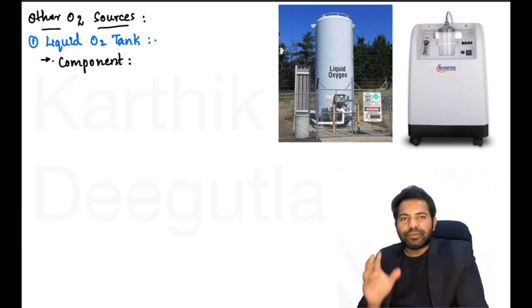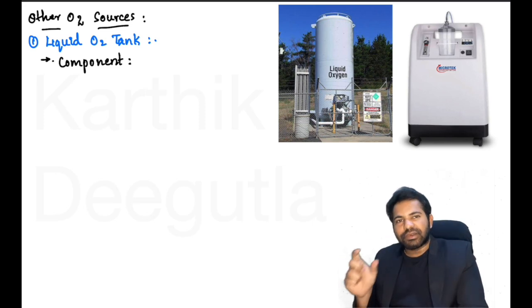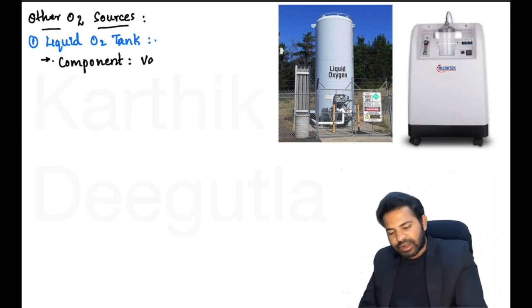It has a vacuum insulated evaporator. Remember this word, vacuum insulated evaporator, or VIE.